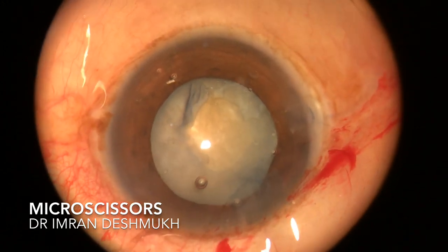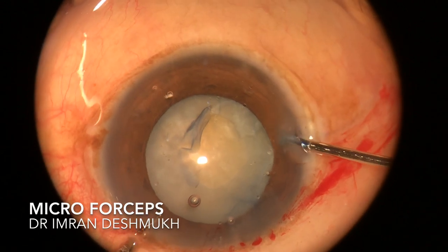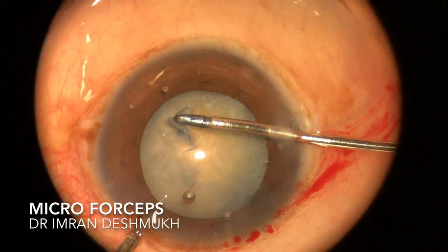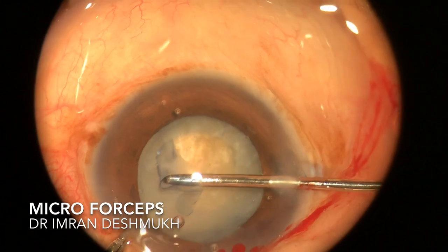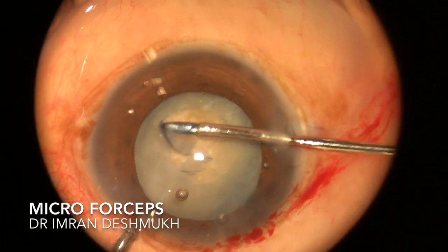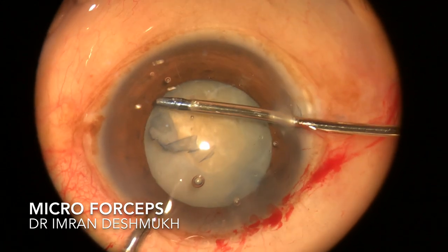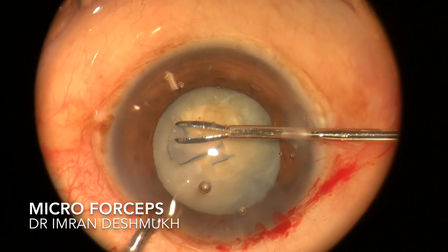I added visco in the anterior chamber to keep the AC well maintained. Once the AC was maintained, I brought in my micro forceps to the side port. These two instruments are very important — the micro scissors and the micro forceps. Always keep them by your side as you can need them anytime. I held the anterior capsule flap and started increasing the size of the rhexis.